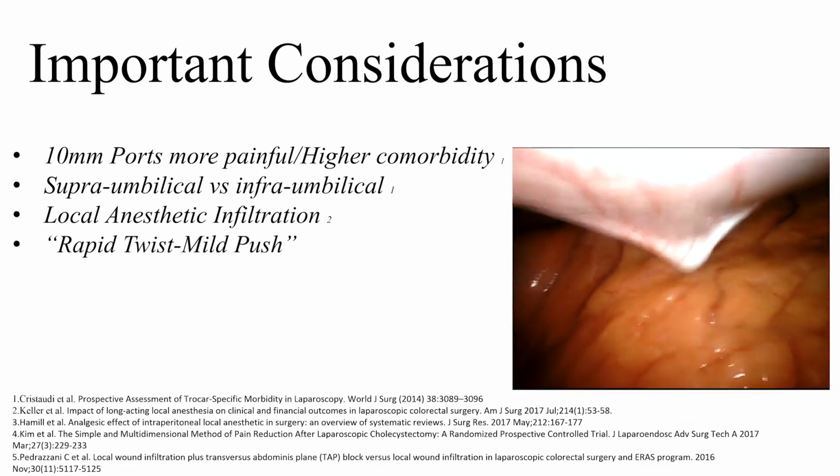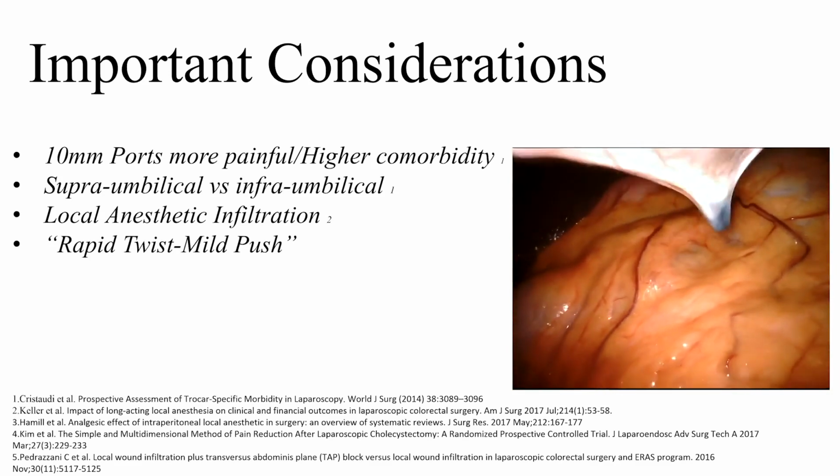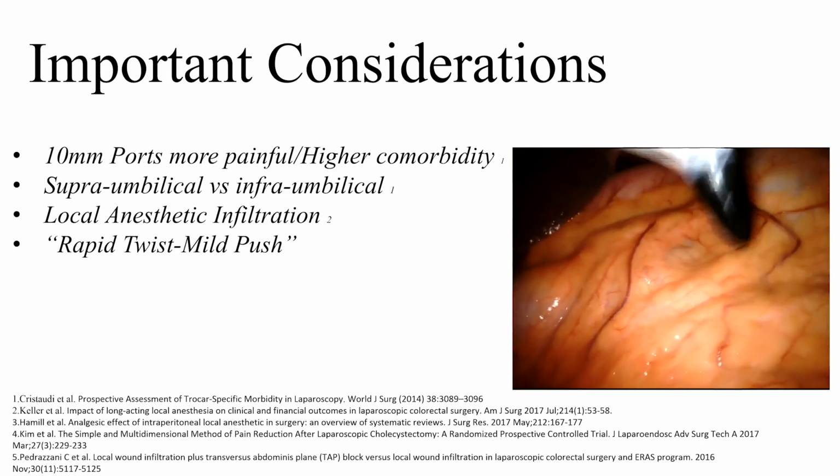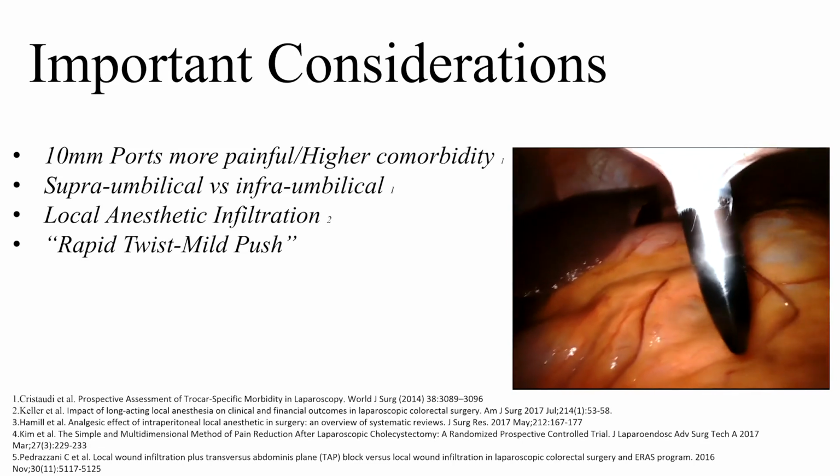Finally, we recommend insertion using the rapid twist, mild push technique, meaning that we rapidly twist the port trocar while only pushing gently, always under direct vision and at a 90-degree angle to the abdominal wall.